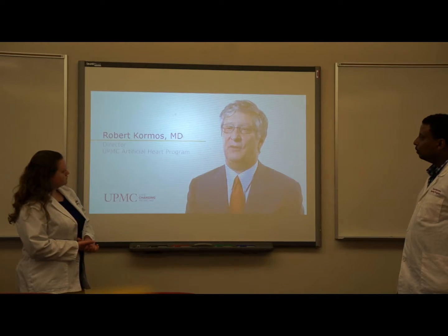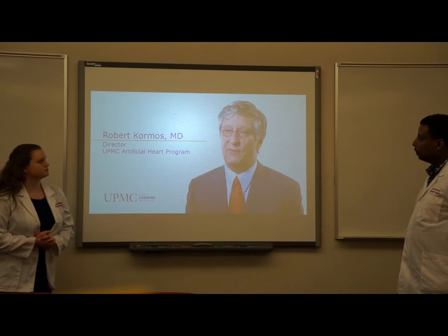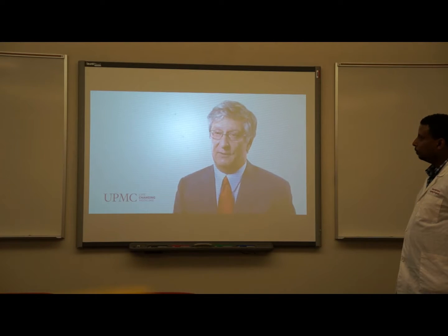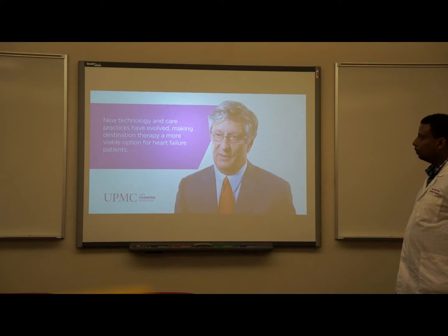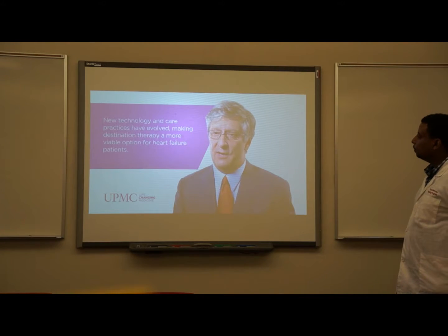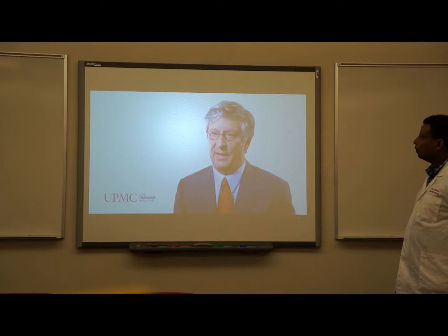Destination therapy with a left ventricular assist device, or LVAD, is a way of treating advanced heart failure in patients specifically who are not considered candidates for a cardiac transplant. The devices that we use, the heart pumps themselves, have become smaller, easier to use, implant in patients, in other words, and the indications for use have changed dramatically.